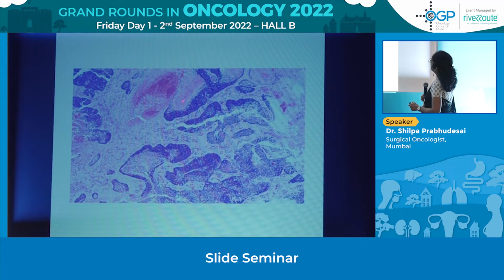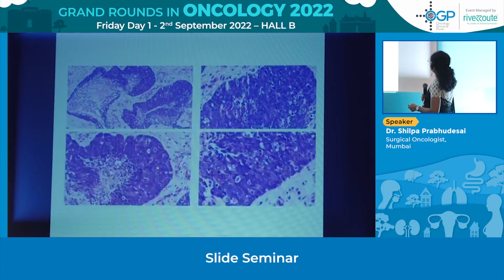It looks very high grade. There are areas of necrosis. And it has a very basaloid look, very irregular kind of cell nest. Not exactly jigsaw puzzle, but again a very high grade looking tumor. And here some degree of palisading, brisk mitotic activity, a high NC ratio.